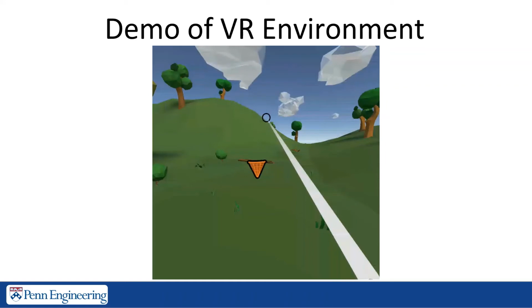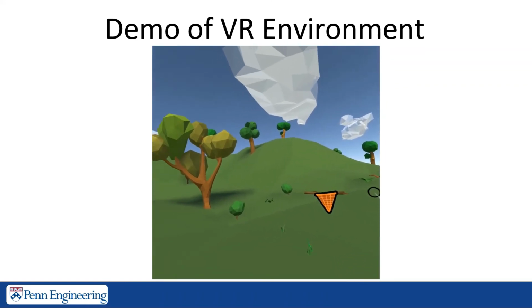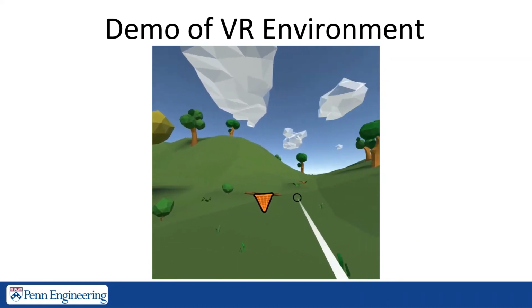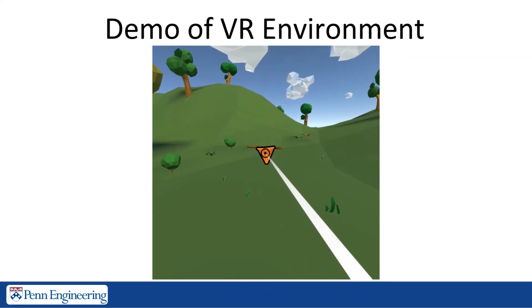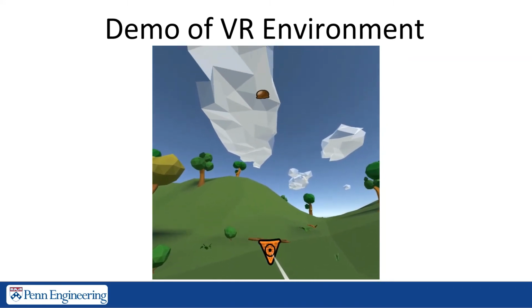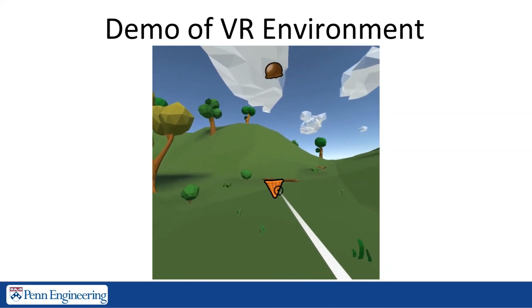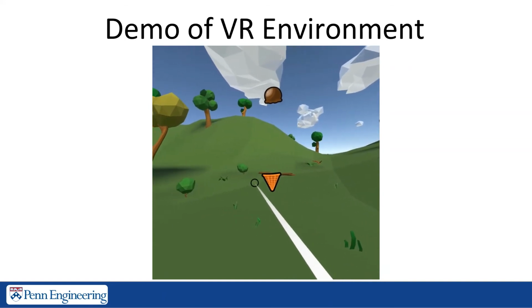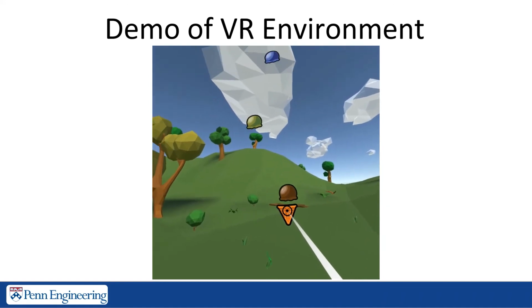Here is a demo video of our game without EMG input. The user is placed within a calming forest environment and has a control array to interact with objects, as shown by the changing reticule of the pointer, such as the cone or an object for EMG calibration. Upon selecting the cone, the game begins with ice cream scoops falling from the sky.